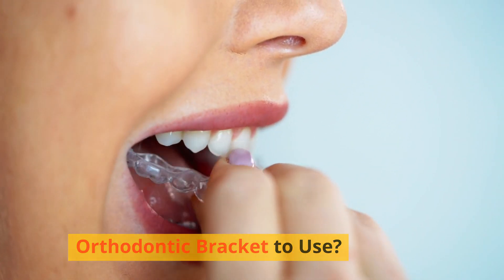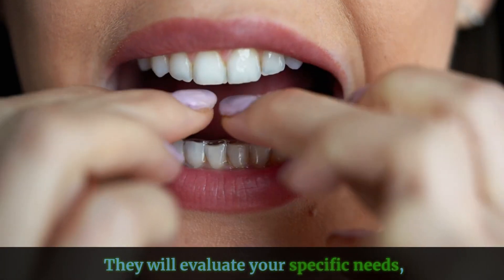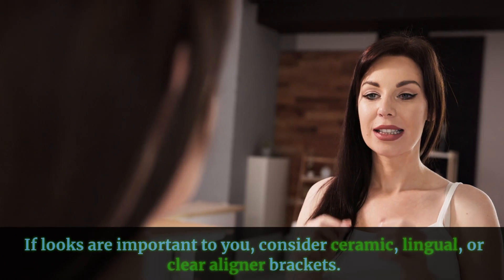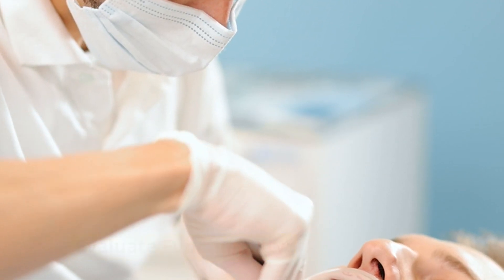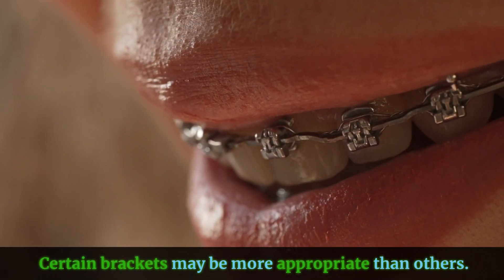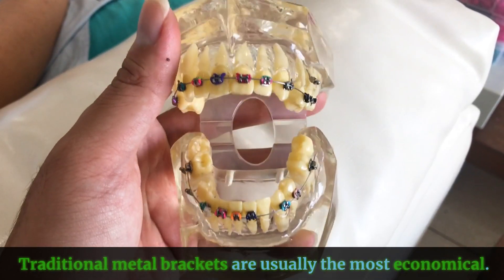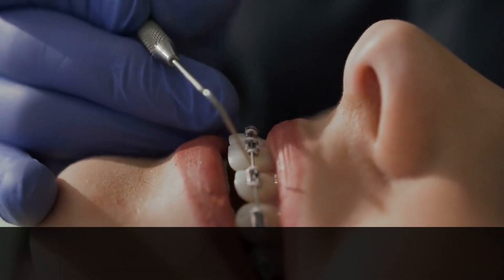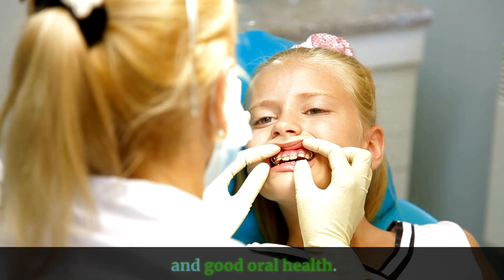To know which orthodontic bracket to use, first consult an orthodontist — schedule a consultation and they will evaluate your specific needs, preferences, and treatment goals. Consider aesthetics: if looks are important to you, consider ceramic, lingual, or clear aligner brackets. Evaluate functionality by discussing your lifestyle, eating habits, and oral hygiene routine, as certain brackets may be more appropriate than others. Also think about your budget and insurance coverage — traditional metal brackets are usually the most economical. Selecting the appropriate orthodontic bracket requires coordination between you and your orthodontist; together you may obtain a beautiful smile and good oral health.